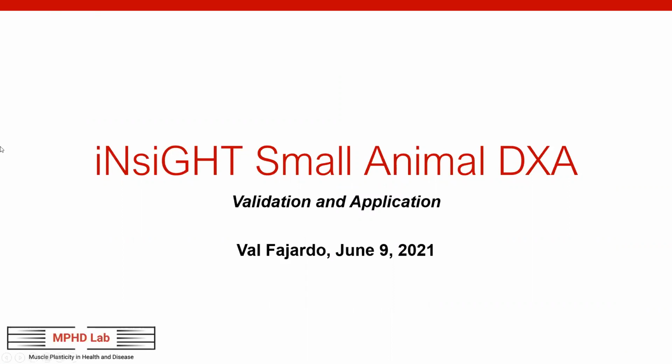As Tanya said, we've had the system here for about 2 months, and really the benefit of the system is how easy it is to use. So we've been able to integrate it really well to many projects. I think there's about 4 or 6 projects that we have just in the small amount of time that we've had this system. I'm only going to show you a few of those projects here, and I should give credit to Sebastian, who you'll see all the data here. That's actually the data that Sebastian collected, and he's become our resident expert on this system.